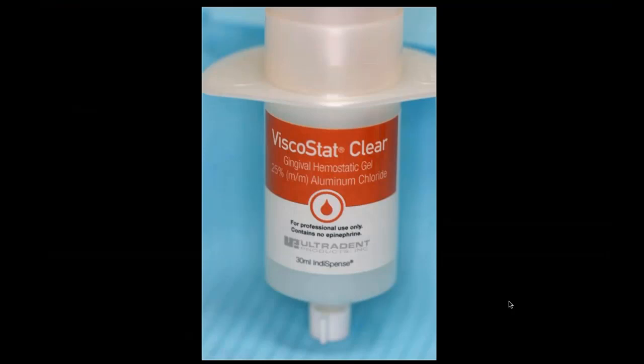A good friend of mine, Rice Bourne, James Clem, we used to do a lot of things together. What we did was put the tray material in the tray, and this is for crown and bridge, and the light body on top. If it works for you and you're getting accurate impressions, that's great. You can do it that way.